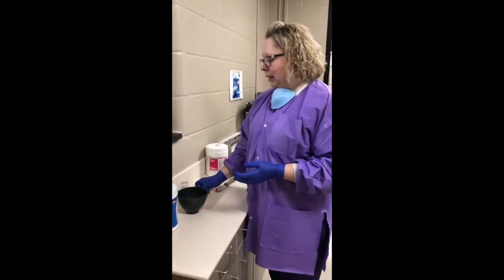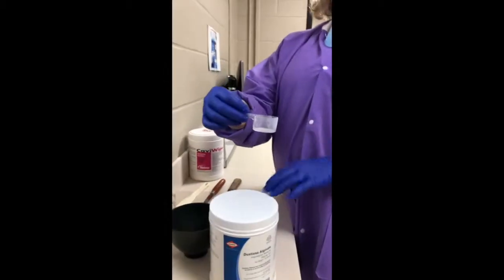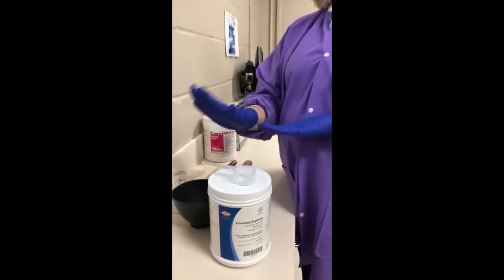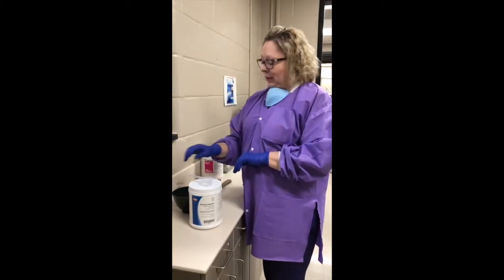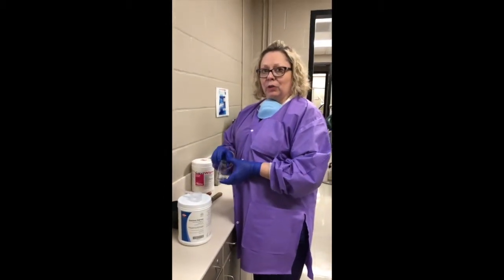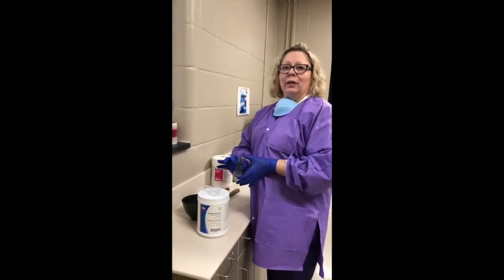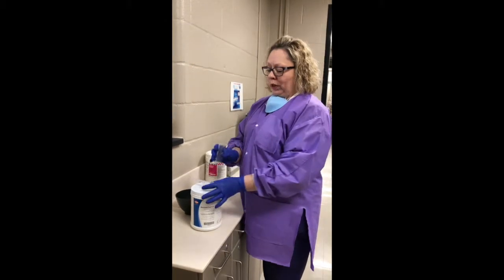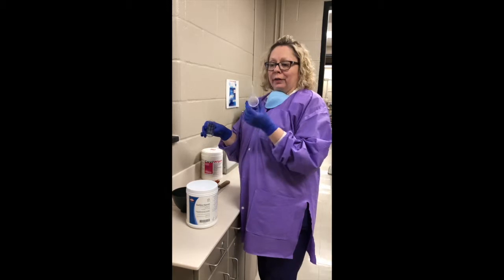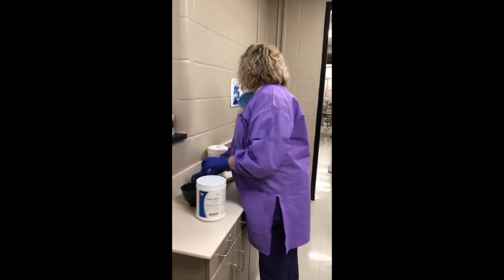We also use, with every alginate impression material, it will come with its own scoop that is the perfect quantity. So if you're doing a maxillary, you would do 3 scoops to 3 units of water. These line marks are the units. If you were doing a mandibular, it would be 2 scoops and 2 units of water. So we use the materials that come with our alginate. You can't just grab any old scoop or any water container, because then you might end up with inaccurate mixes of your product.